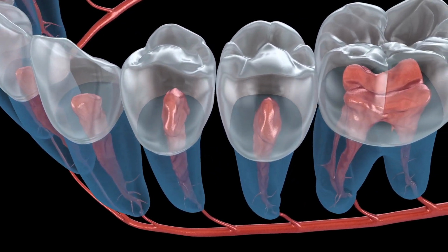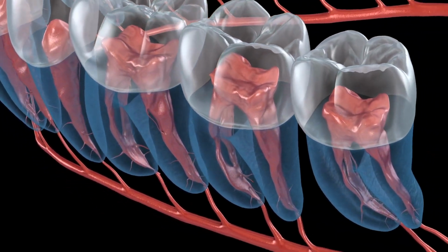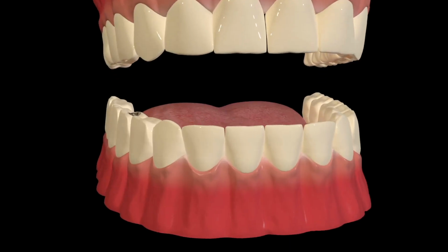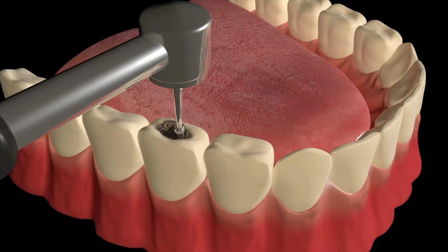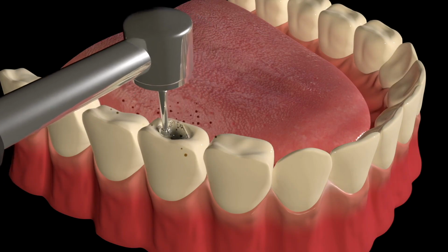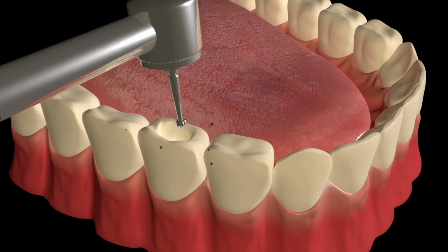The caries removal procedure starts with a thorough dental examination. Your dentist will visually inspect your teeth and may use dental x-rays to determine the extent of the decay. Local anesthesia is typically administered to numb the area and ensure a pain-free experience.